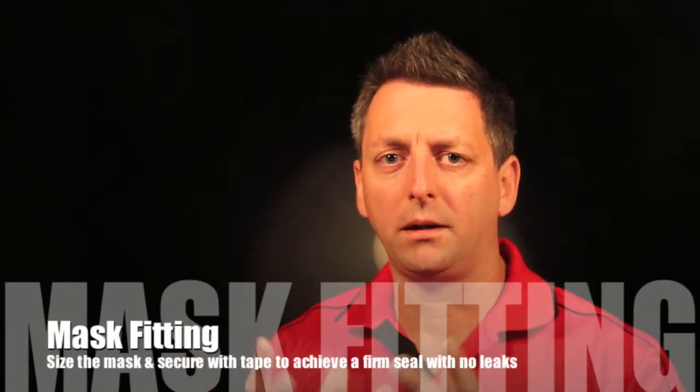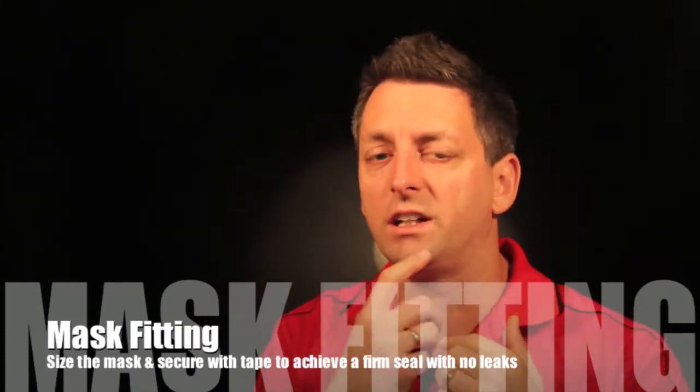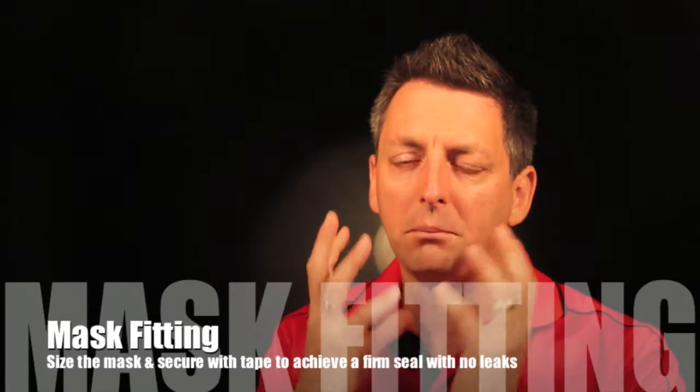So when we fit the mask, I always put tape across the bridge of the nose, around the sides of the cheek and the chin, if I can. If it's a big bearded person, you can shave around the chin if you need to, or you can just get a bit of clear plastic dressing, put that over, and that can create a bit of a seal quite quickly as well.